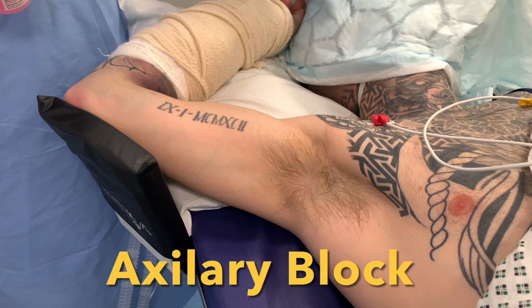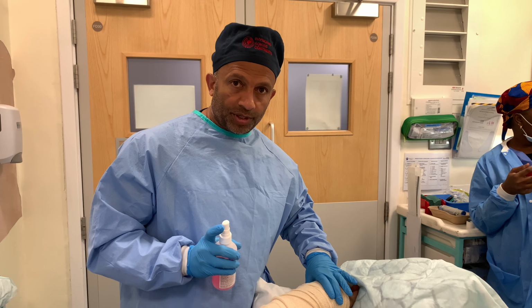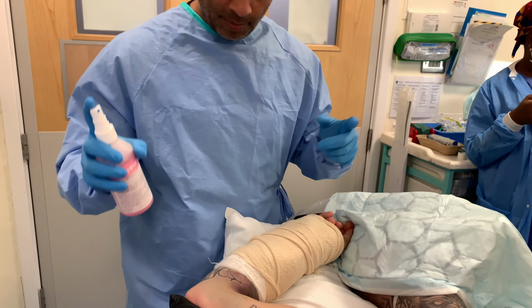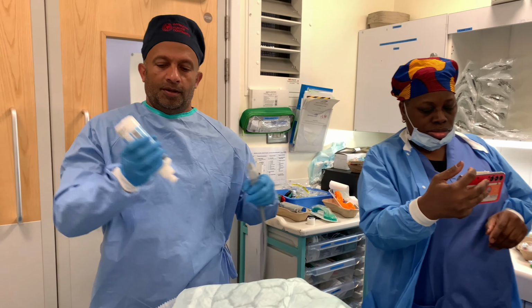Axillary block is very easy to do. Let me show you a quick axillary block. This patient is going to have an operation on the wrist, especially on the radial aspect. Patient's consented, mark, cleaning, lots of gel.